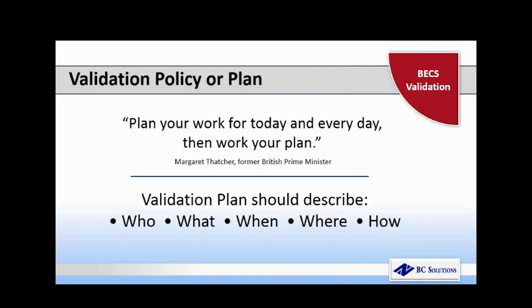What do we need to answer when we're looking at these questions? When you're thinking of when, you need to decide beforehand when you are going to perform a validation. The regulatory documents state that you need to perform a validation with install of a new system, at routine intervals or routine changes, and when there's a major change made in the system.